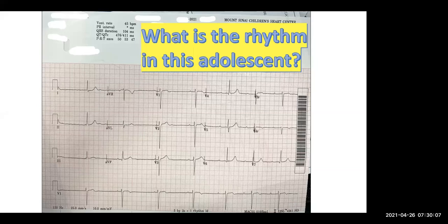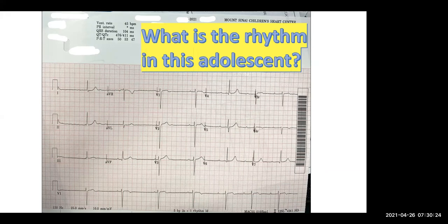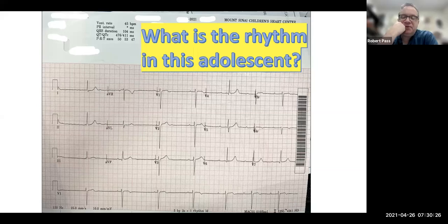Okay. And I would also look at, and what is the finding that makes you think that the patient could have myocarditis? I'm not disagreeing with you, but what is the electrophysiological finding that makes you concerned about that possibility? The first degree heart block. Yep, I agree. First degree heart block could be a residua of myocarditis for sure. Okay.